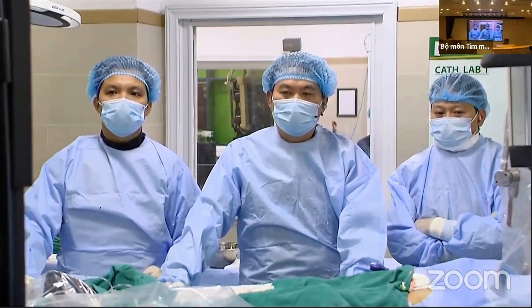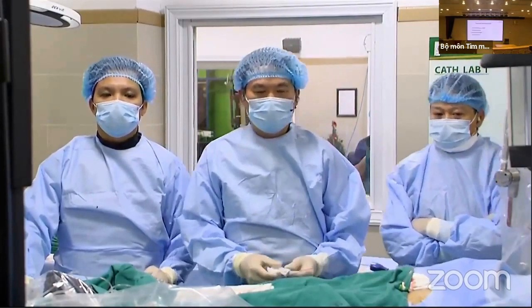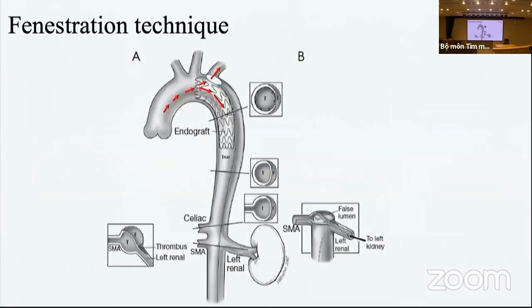So almost all the panelists try to cover as long as they can and try to preserve the left subclavian artery. So what about your strategy, Professor Hung? Okay, thank you so much for your comments. Actually, our strategy for this case, we also plan to do a fenestrated TEVAR for this case. So next slide, please.